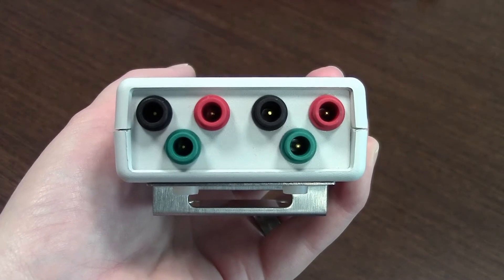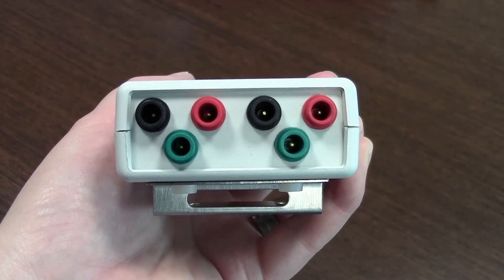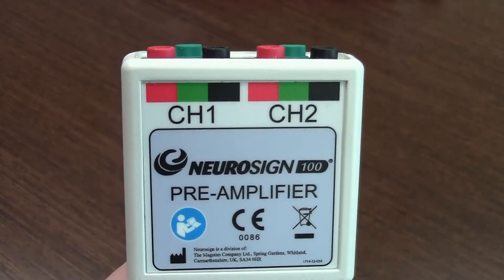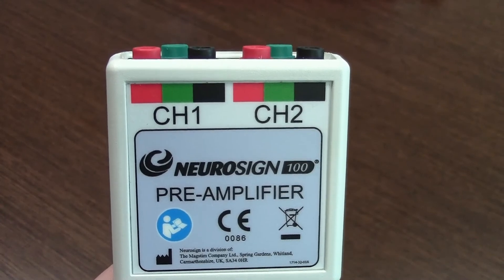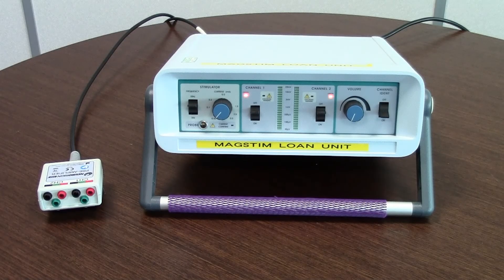To check the pre-amplifier pod, ensure that all pins are intact in the red, green and black inputs. The pre-amplifier pod allows you to connect two channels to the two-channel nerve monitor. To check that the pre-amplifier pod is working correctly, switch the monitor on and put a piece of wire in channel 1 and channel 2 as shown.